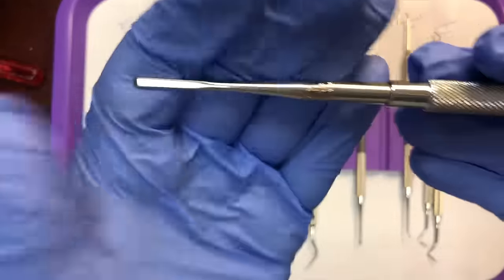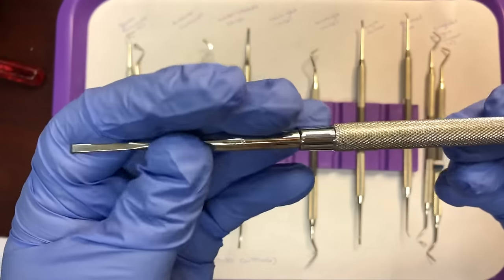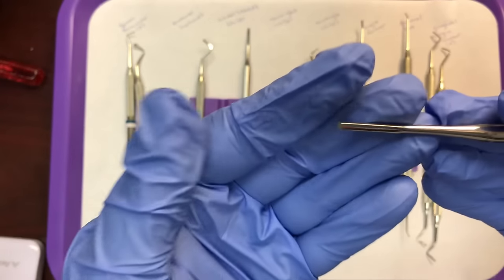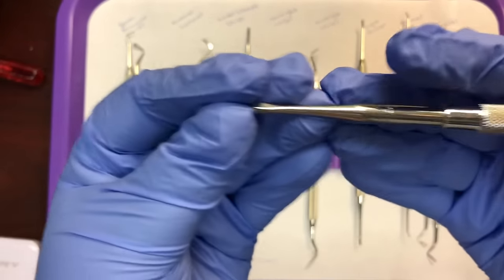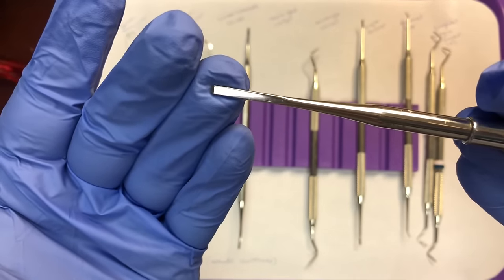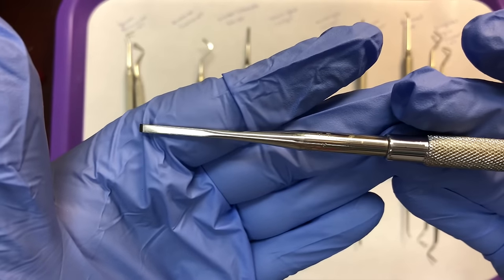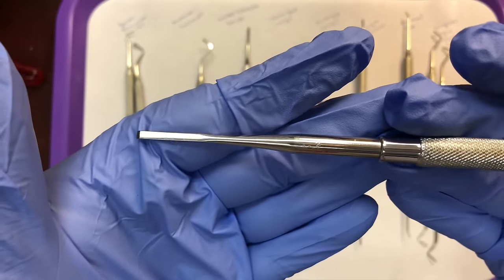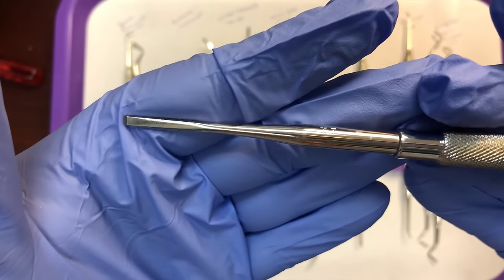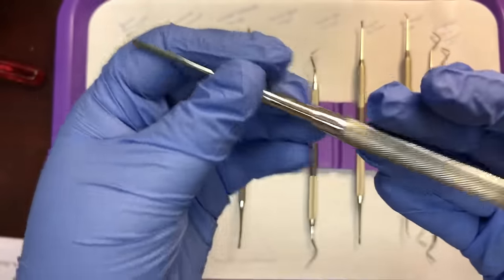Next up is a straight chisel. From the handle, through the shank, to the working end, it's straight — that's why it's called a straight chisel. Chisels are used to prepare the teeth and create smooth walls. That is your straight chisel, used to prepare the tooth.